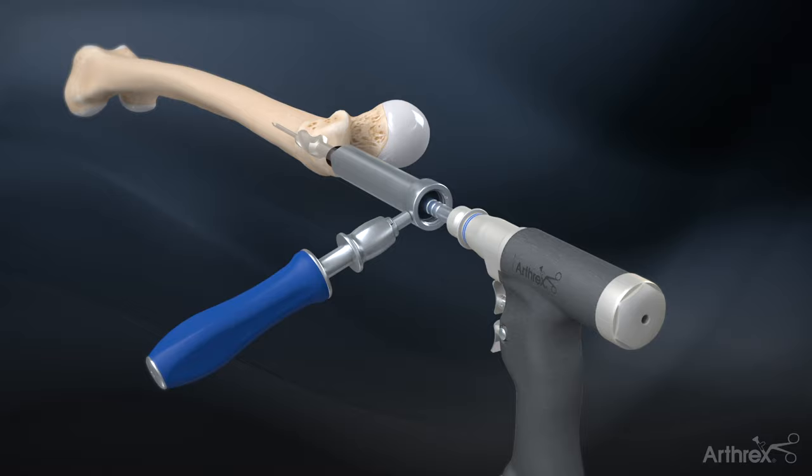The depth is determined by the first indentation of the reamer lining up with the top of the soft tissue protector.